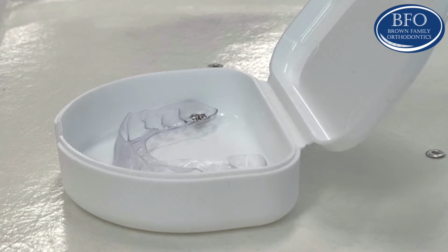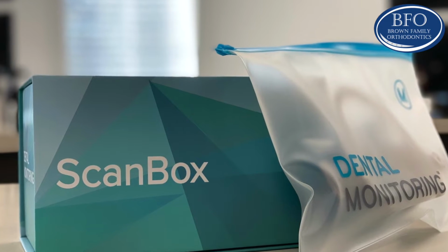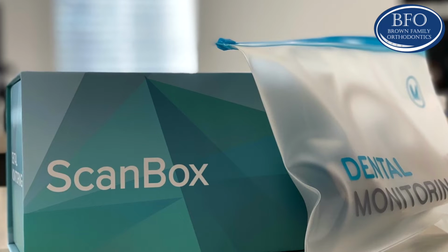They're changed either every week or every 2 weeks. And in conjunction with that, we love to use some technology known as dental monitoring, where the patient takes an intraoral scan of themselves every week on a prescribed day using their cell phone, which is uploaded to us, and an artificial intelligence then indexes that scan where the teeth are to where they're supposed to be to make sure that everything is tracking and progressing the way it's supposed to be.